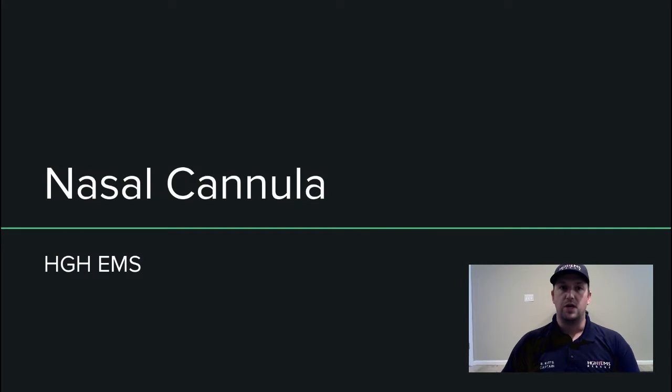Next, we'll review two topics related to nasal cannula application for RSI. First, we'll cover nasal cannula application, which will be reviewed again later during the RSI setup/preparation video. And then next, we'll look at a flow rate demonstration between an end-tidal cannula and a non-end-tidal cannula.